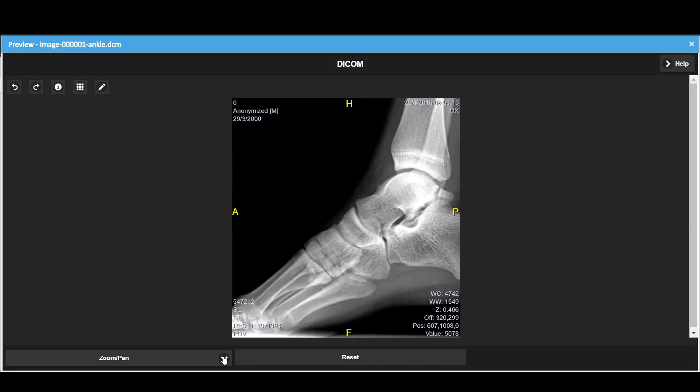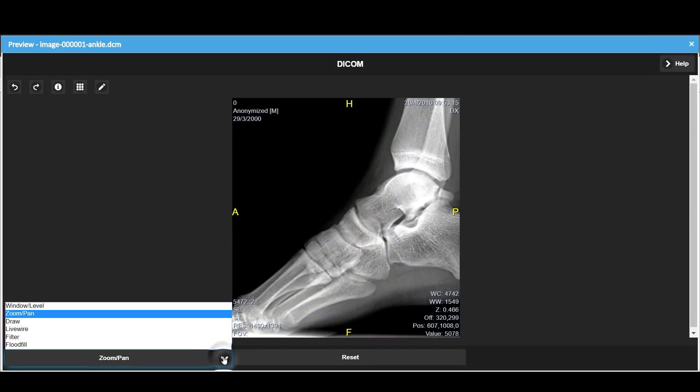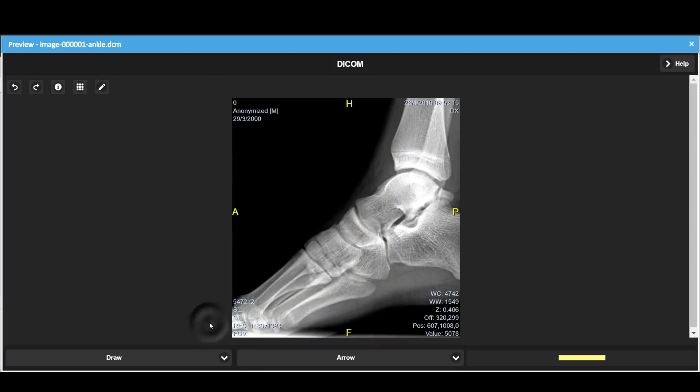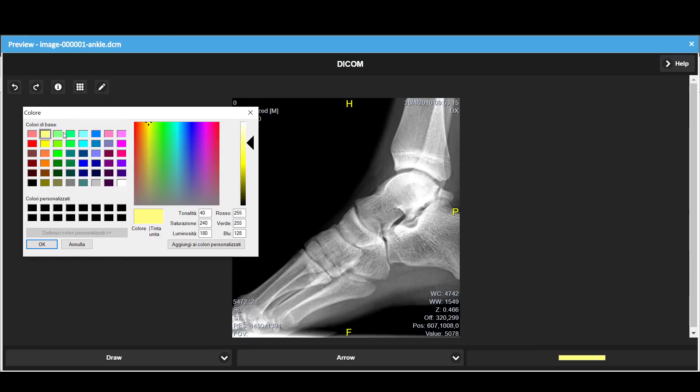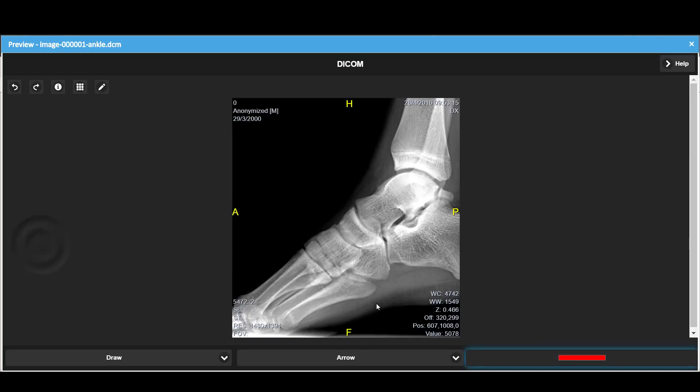Now let's draw on the image. We select a color, and with the ruler tool, we can measure a distance.